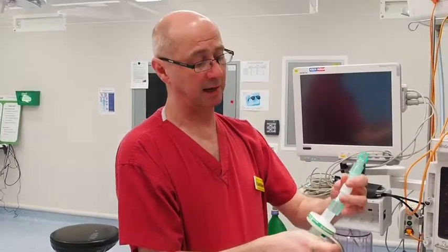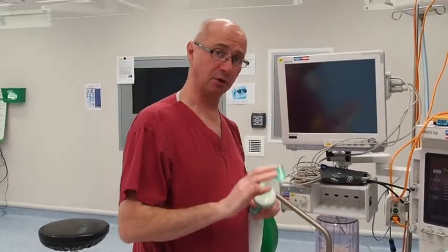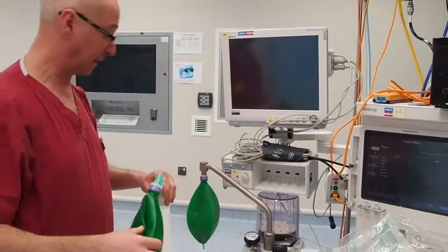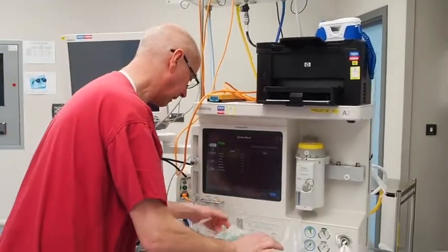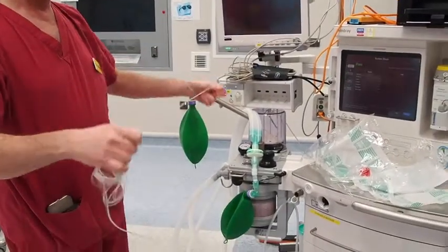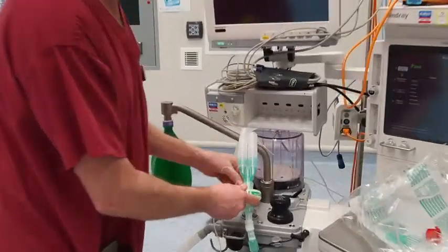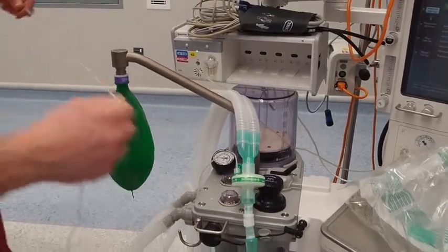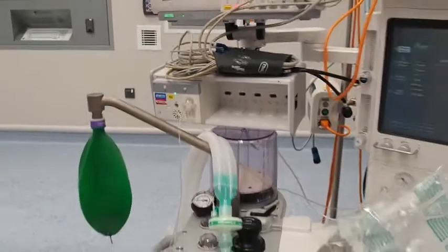And then one, just like you would in ICU, on the catheter mount. This will be a standard ICU catheter mount with the suction, as you would do on the unit. I'm going to put a big bag on here just to replicate the patient, like a test. Monitor, turn on, and we'll have a capnograph sampling tubing, which is a bit different to our ICU tubing. It's much more simple and it doesn't have a filter in it. And I'm going to take that straight off the HME and screw it into the HME port here, which is different to ICU. And the sampling tubing will screw into the gas module there.